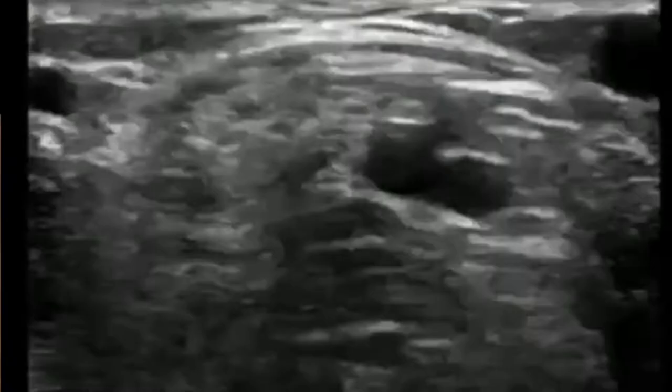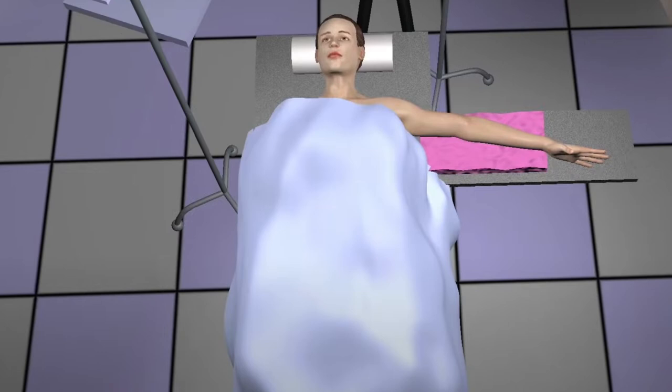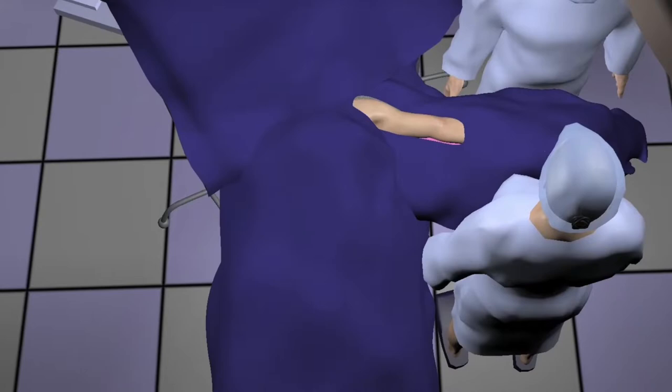We routinely perform vein and arterial mapping of the entire limb before commencing the procedure. The patient is placed supine and the left arm is placed in an abducted position 90 degrees from the body. This is the operating room setup we prefer.